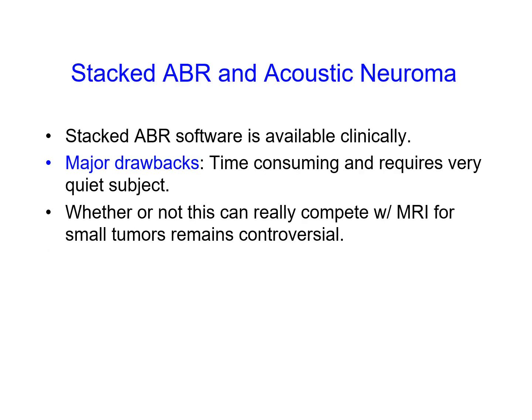So this is a summary slide for stacked ABR to detect tumor. Stacked ABR software is available clinically. However, the major drawbacks are it's very time consuming because it is based on derived band ABR recordings. As you know, derived ABR recordings are time consuming. And it requires very quiet subjects, because if the subject is noisy, then you don't get good ABR recordings, especially in the different masking noise conditions. So these are the two major drawbacks for stacked ABRs.